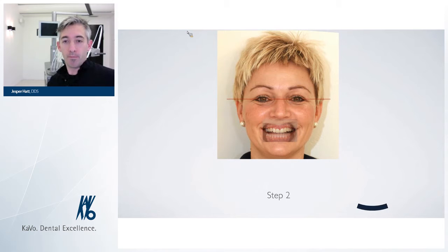That we have taken. And usually when we do planning, we always start with photos of the patient. Sometimes we take some videos as well to get lip dynamics and to make an emotional connection with the patient, which I will get back to a little bit later. So we take our intraoral photo, we make an overlay of the existing photo, and then we copy the horizontal line and paste it into the position that fits our needs.